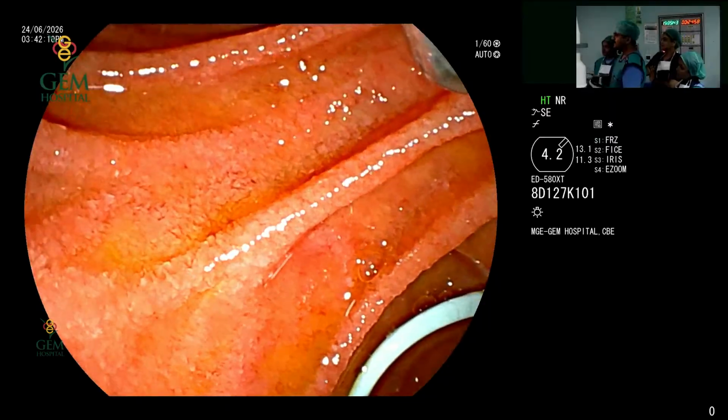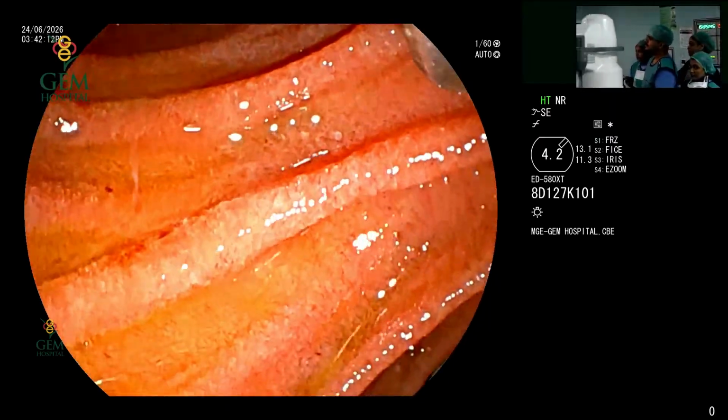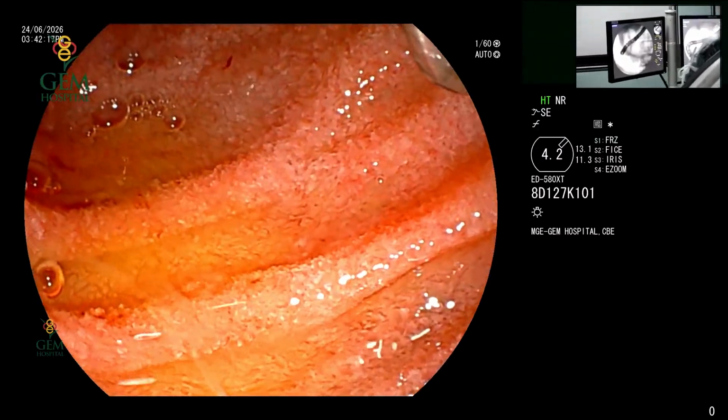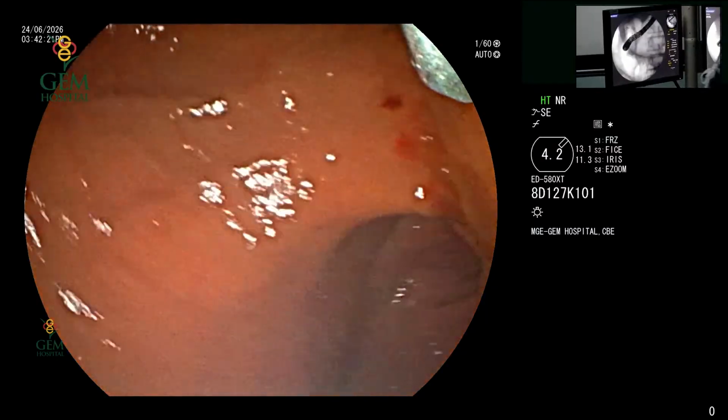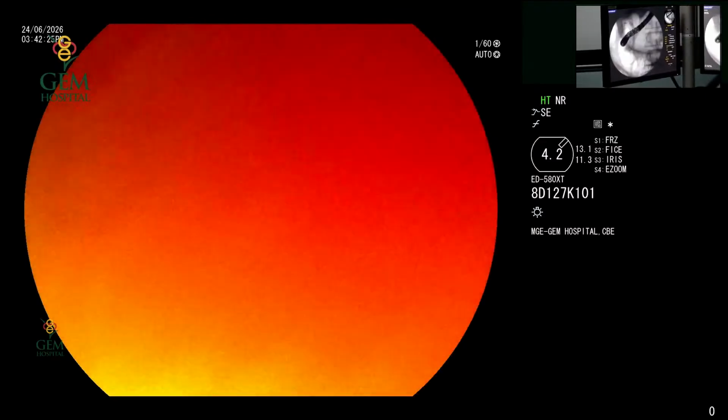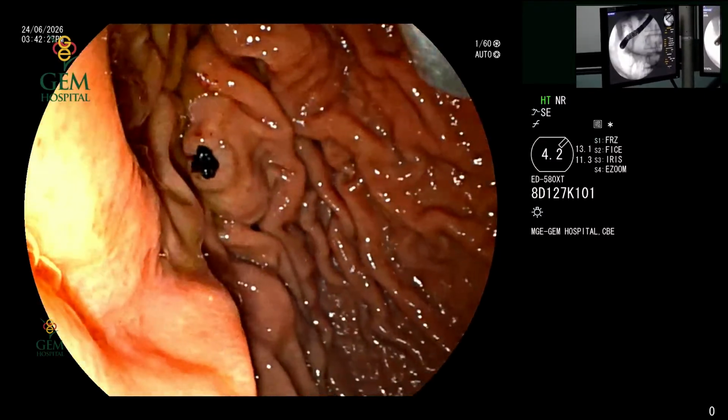Can we have the final screen to check the position of the stent? Yeah, you can explain. In the cholangiogram, since we have withdrawn the scope, we have lost the hockey stick position. We are just seeing the stent beneath. I hope the stent is clear. You can see the distal pigtail in the lumen. We'll have the proximal pigtail even more above.